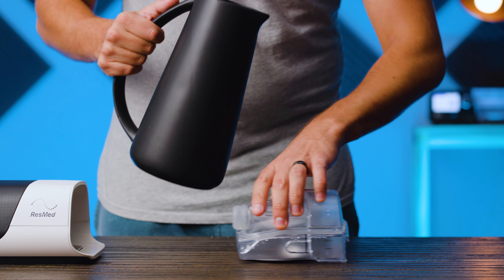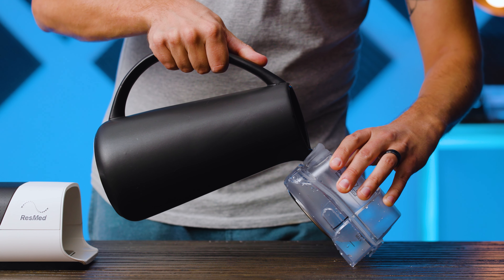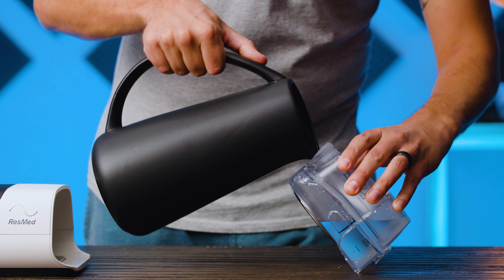Now, turn the chamber to a 45 degree angle and fill it through the opening with a jug. Keep filling the chamber until the marked line is submerged. By keeping the chamber at 45 degrees, you will be able to fill it without any water escaping from the other openings.